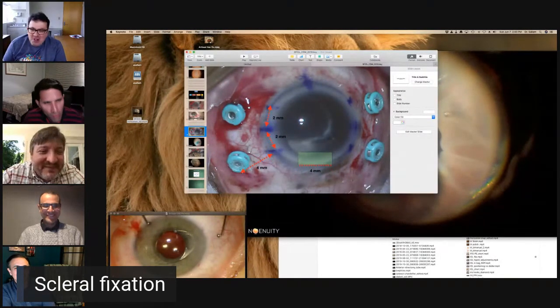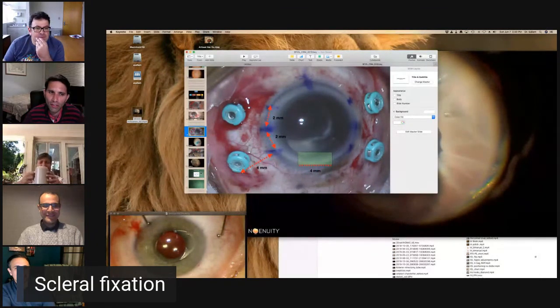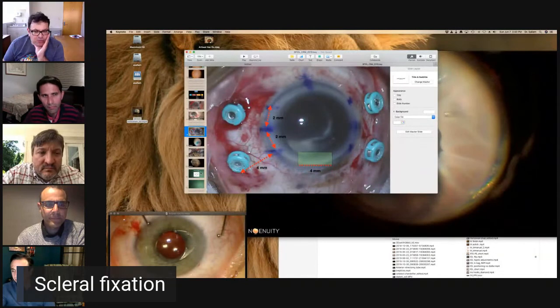Did you find, Ahmed, that the Gore-Tex slips with the slip knot? Because braided sutures don't slip very well, and I found doing a slip knot with the Gore-Tex a bit more tricky. It's not braided. The Gore-Tex is not braided. It is very, very slippery. I don't find it difficult at all. On the contrary, it works very well.